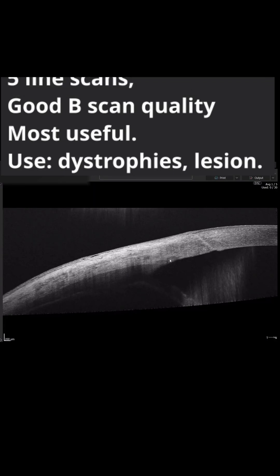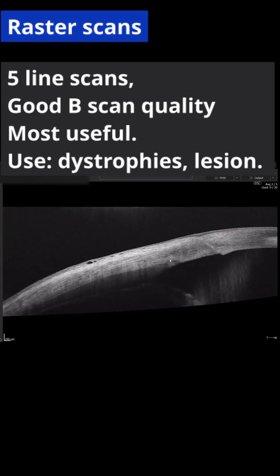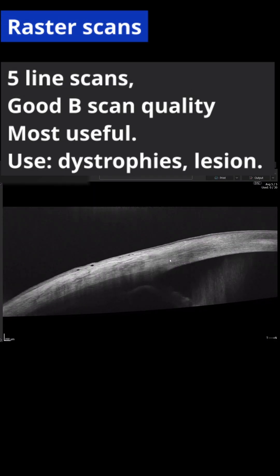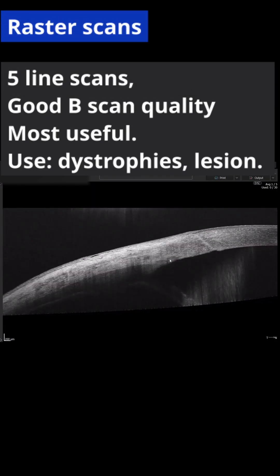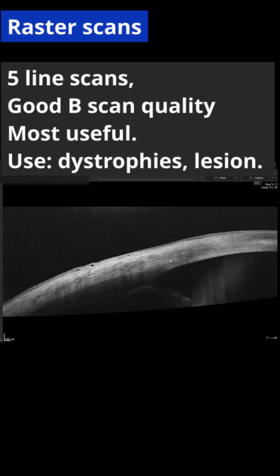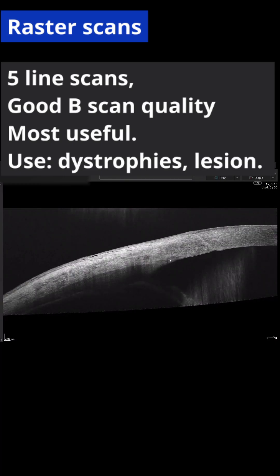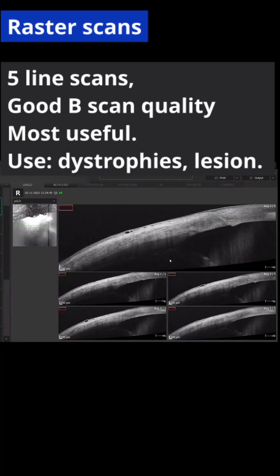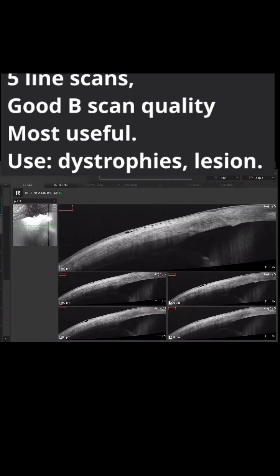Then we have the raster scans, which are five line scans with good B-scan quality. These are most useful because you don't need to locate the lesion precisely.